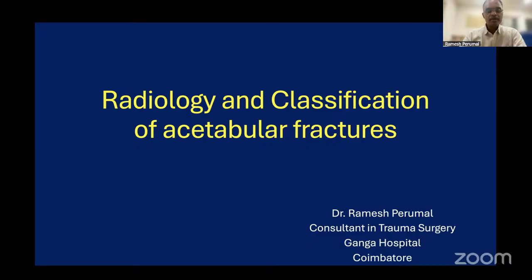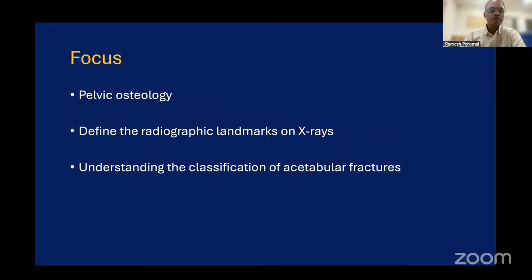Of course, all classifications in orthopedics start from X-ray. The radiology has further moved on to the CT scan and other investigations. However, most acetabular fractures can be diagnosed with plain radiographs alone and with special use of Judet views.